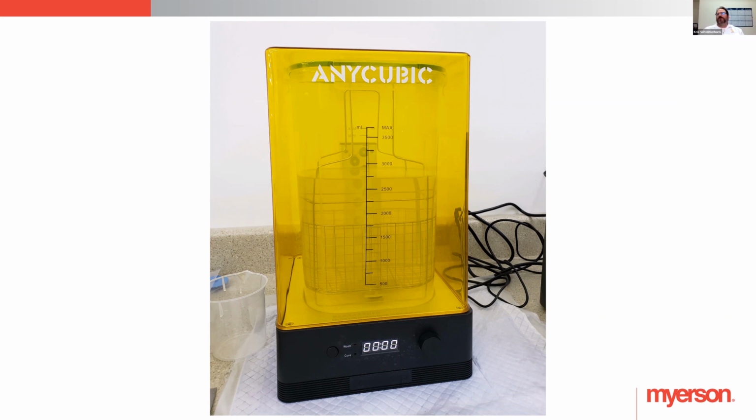If there is, you can take a squirt bottle with some clean IPA in it and kind of hit those areas specifically. But it is very important that you get all the residual resin off of that material, because that's just going to allow for an accurate fit. So that what you have in your hands is actually what you created digitally. It doesn't have any of that residual resin, because once you take that and you go to your light cure, it's going to take that residual resin, it's going to solidify it, it's going to set it up. And then that's going to be added to your denture, which will be not exactly what you digitally designed.